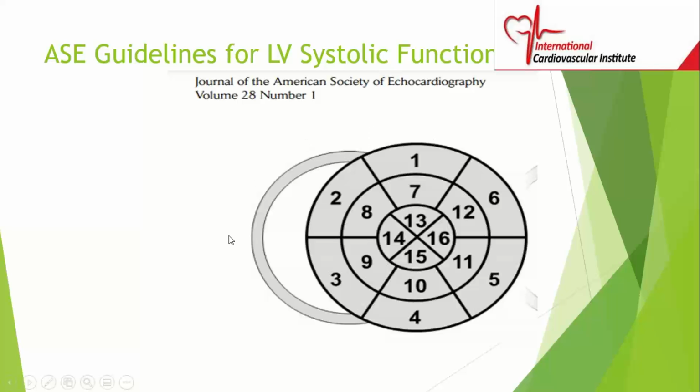The reason we have this is because this is the RV wall and the RV cavity is right there. So this is the left ventricle, and we put everything together so we can just look at it and determine, if segment 1 is abnormal, we know where segment 1 is on the heart.